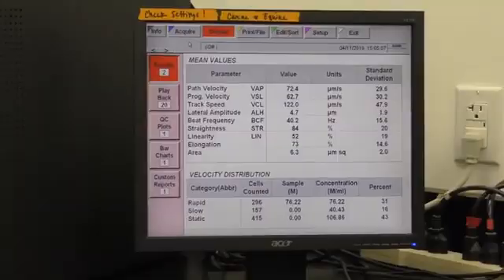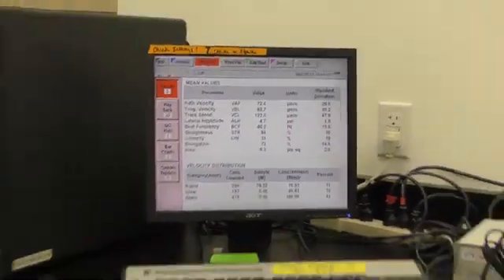Total motility, you could have a sample that has a very high total motility, but none of them are progressive. Meaning you can have 70% total motility, but most of the cells are going in a circle. So what does it mean when a cell is moving progressively versus non-progressively? It really is just a measure of how relatively healthy that cell is, and maybe also gives you a clue as to what its morphology is.